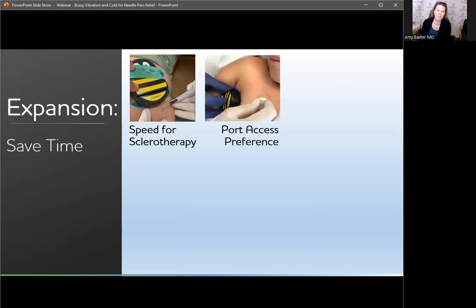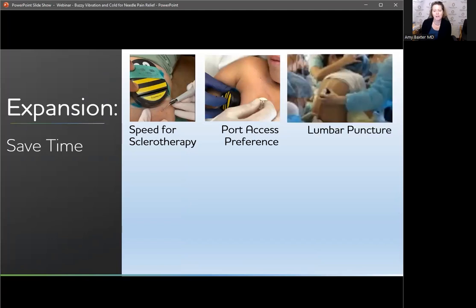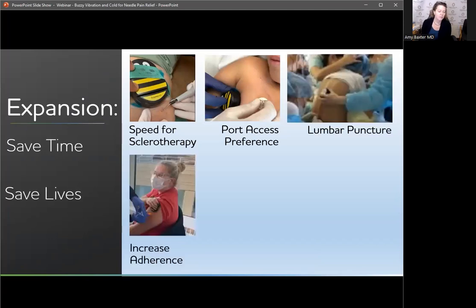One of the interesting studies from Sweden found that the children who had been on chemo for over 6 months preferred Buzzy for their port access to EMLA. Not because it was better at controlling pain, it was slightly non-significantly worse, but because it was fast. They didn't want to wait an hour for the cream to work. And it's been used in France for lumbar punctures.